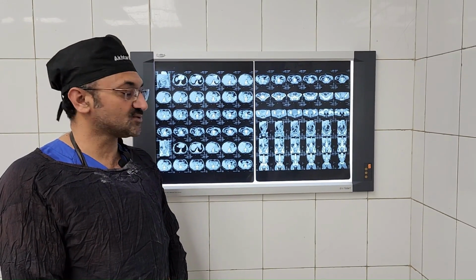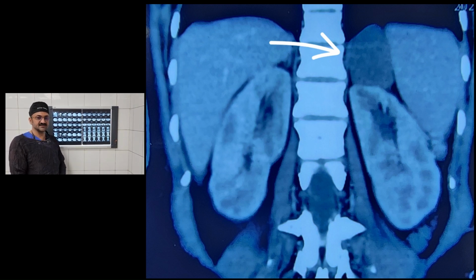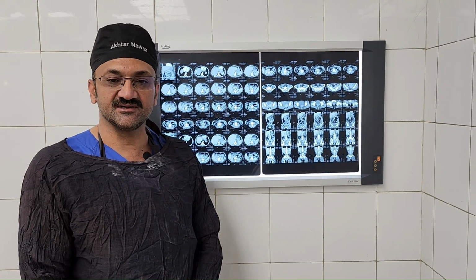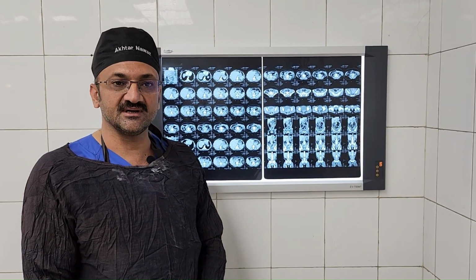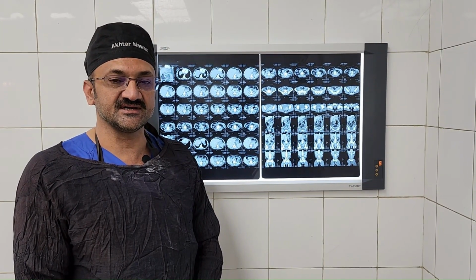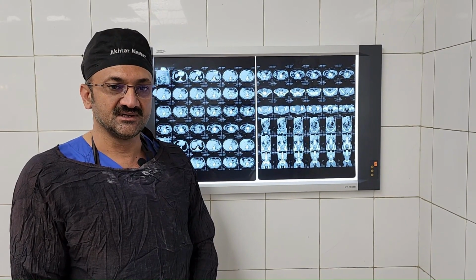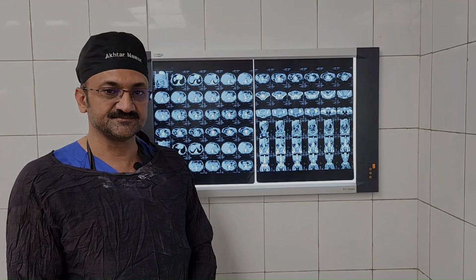This is a 40 years old lady who presented with a solid mass of 4.5 to 4.8 centimeter in the left adrenal region, and she was investigated for cortisol secreting tumors, for pheochromocytoma, for aldosteronoma, and on investigations it turned out to be a non-functioning solid adrenal mass. So we decided to perform a laparoscopic left adrenalectomy in her.